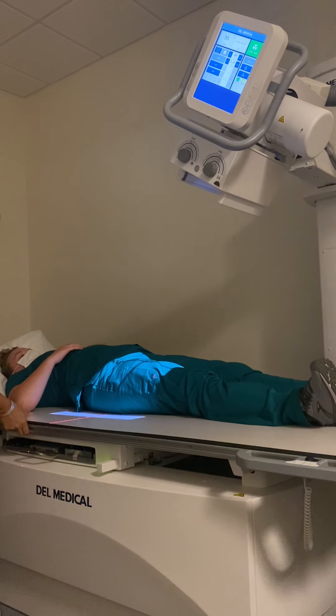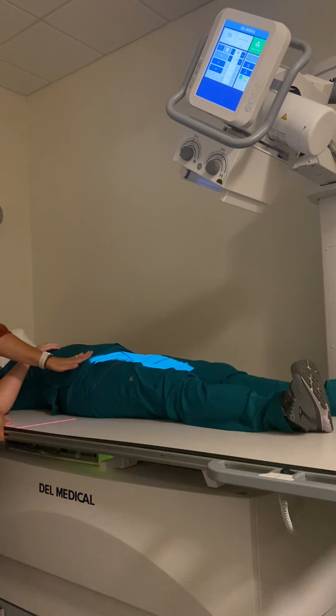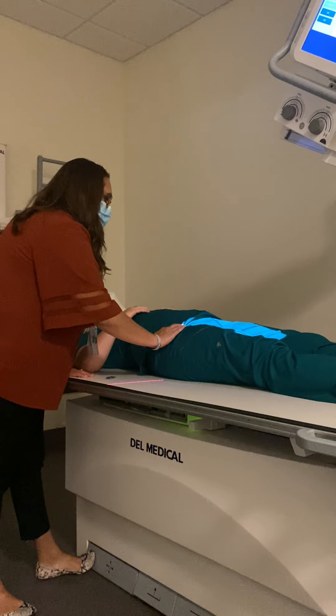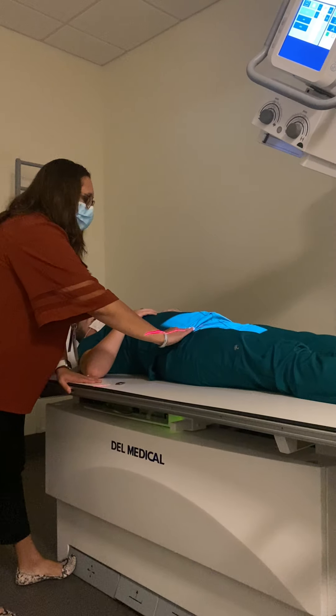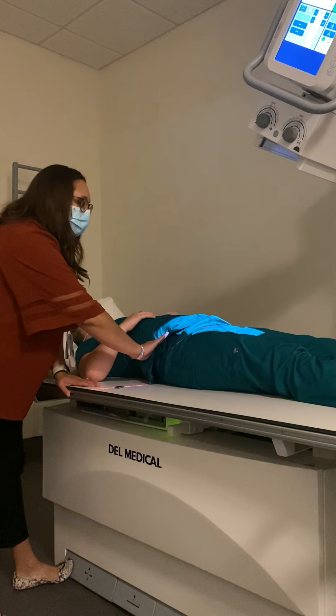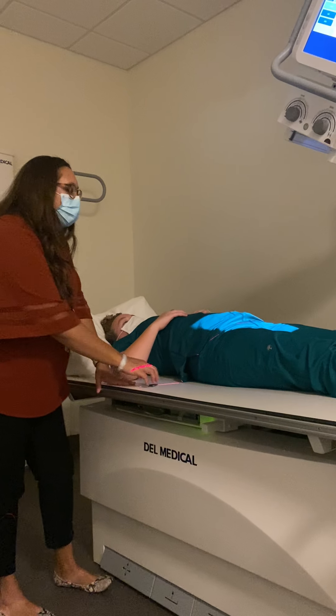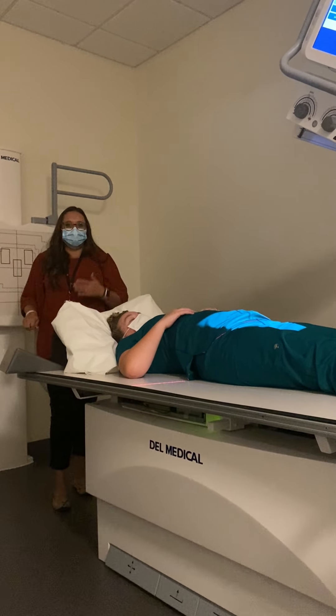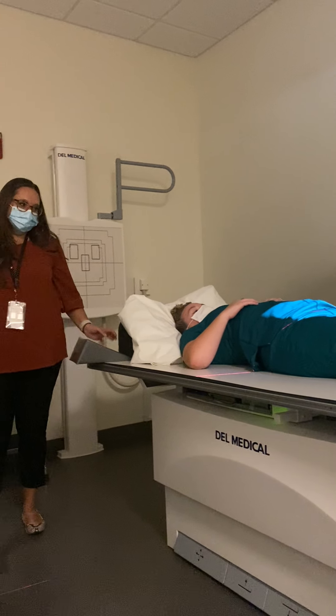For my central ray point, I want to find the ASIS and center two inches inferior to the ASIS — just like the pelvis, the same centering. I also want to double check to make sure that I have light to the top of the iliac crest, because if I have the iliac crest, then I know I have the entire SI joint on there.